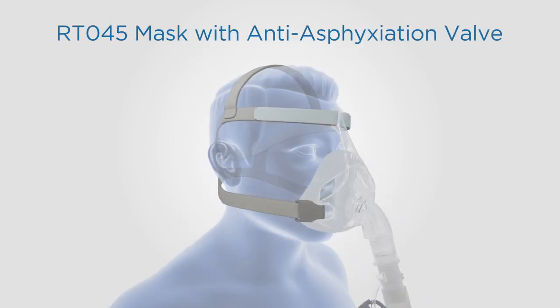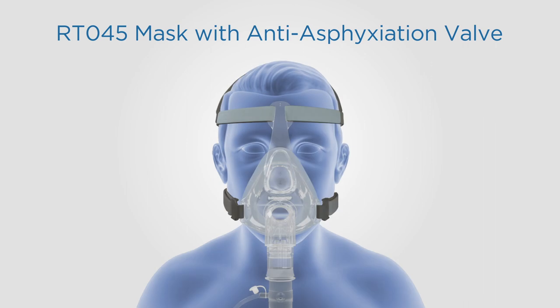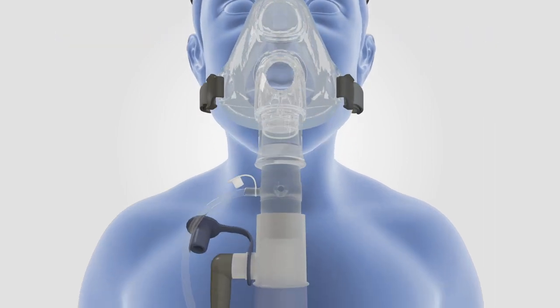The Navarro RTO45 mask with anti-asphyxiation valve is designed to be used with a single limb passive vented circuit system. An exhalation port must be used with this mask style. The clear color of the elbow indicates there is an anti-asphyxiation or non-rebreather valve for safety in the event of ventilator failure.